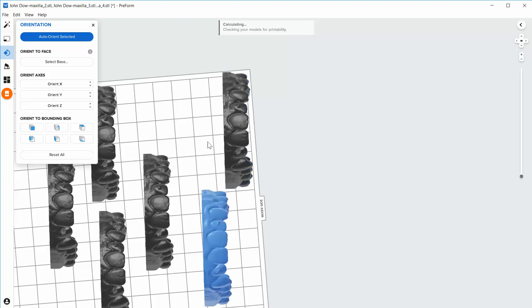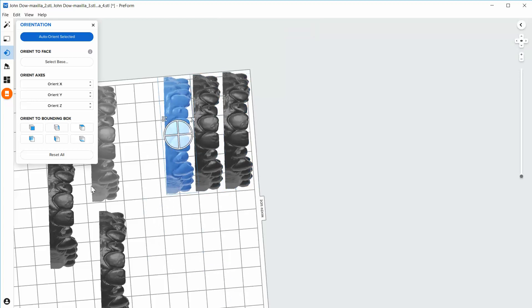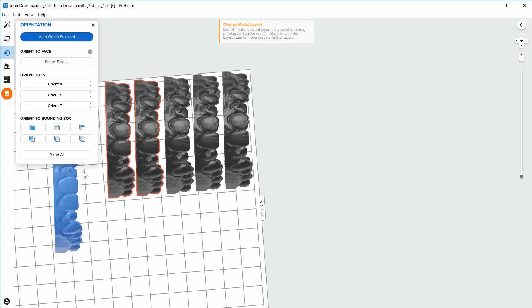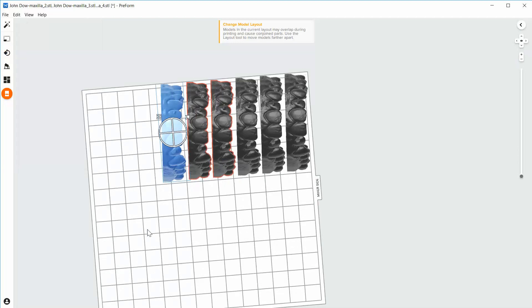Now I can move these around — push that up into the corner, push that up into the side right behind it. You can get fairly close and fit a lot of models on here this way. And that's it. At this point I'm quite literally done, and I can close this menu out.